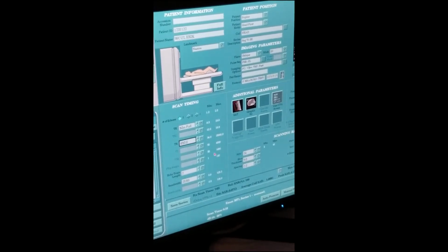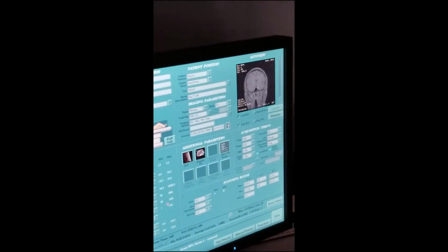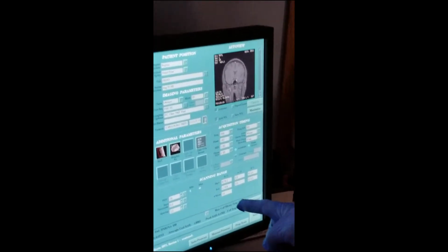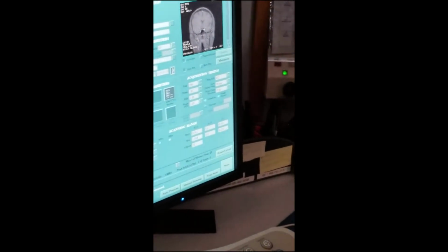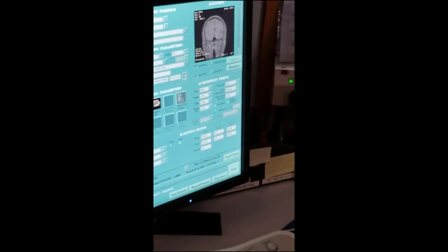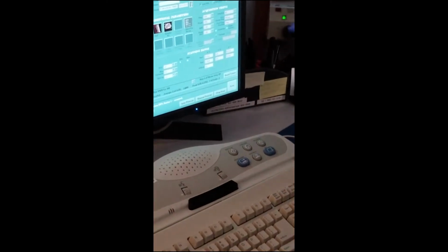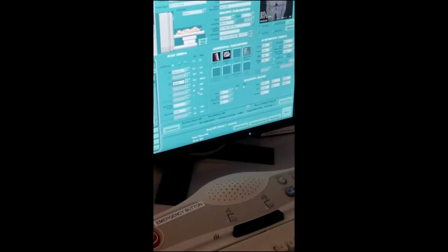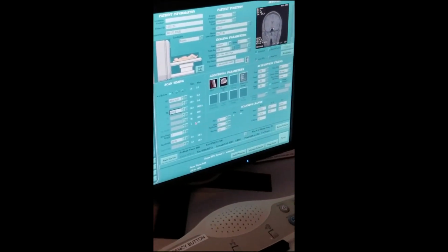But I want something to be clearly learned here, which is a problem with all the students that don't get me in the beginning. These two do not have to match at all times. But it has to be at least the minimum number of slices. Only in certain circumstances do they need to match. One of those circumstances is on T1. Why do we say match? Because we want this to be as short as possible. In order to be as short as possible, automatically they match.